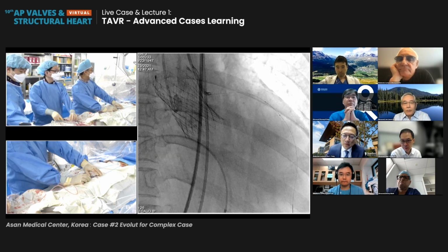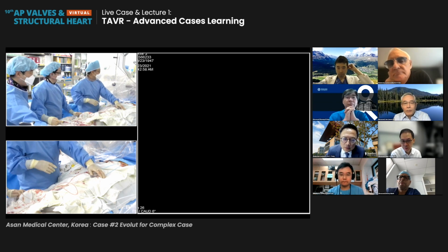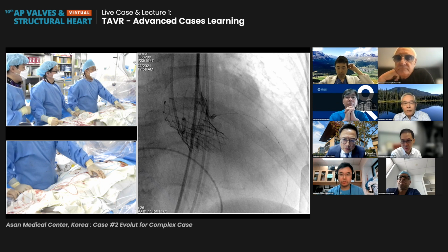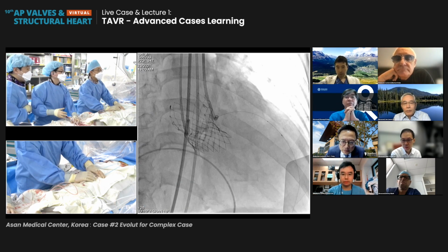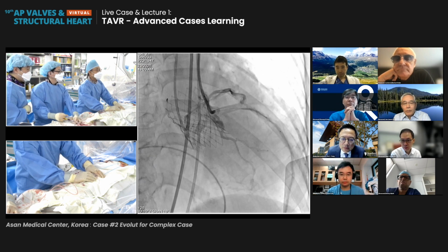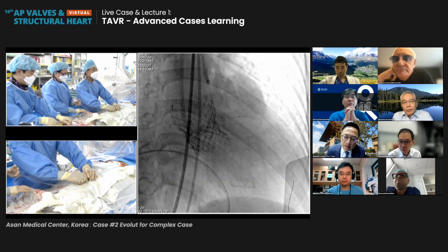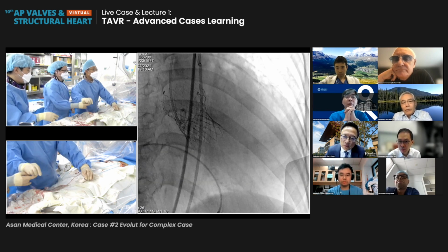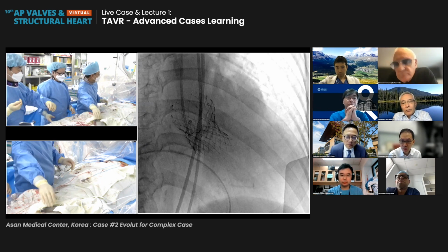I think the space is okay. Lower it a bit. Shall we prime? Make it a bit easier to see. Okay, got it. Angio ready? Ready? Full shot. So the coronary ostium is okay. We have no further concern about the coronary ostium. Pull back the wire. Okay, with that done, now let's look.